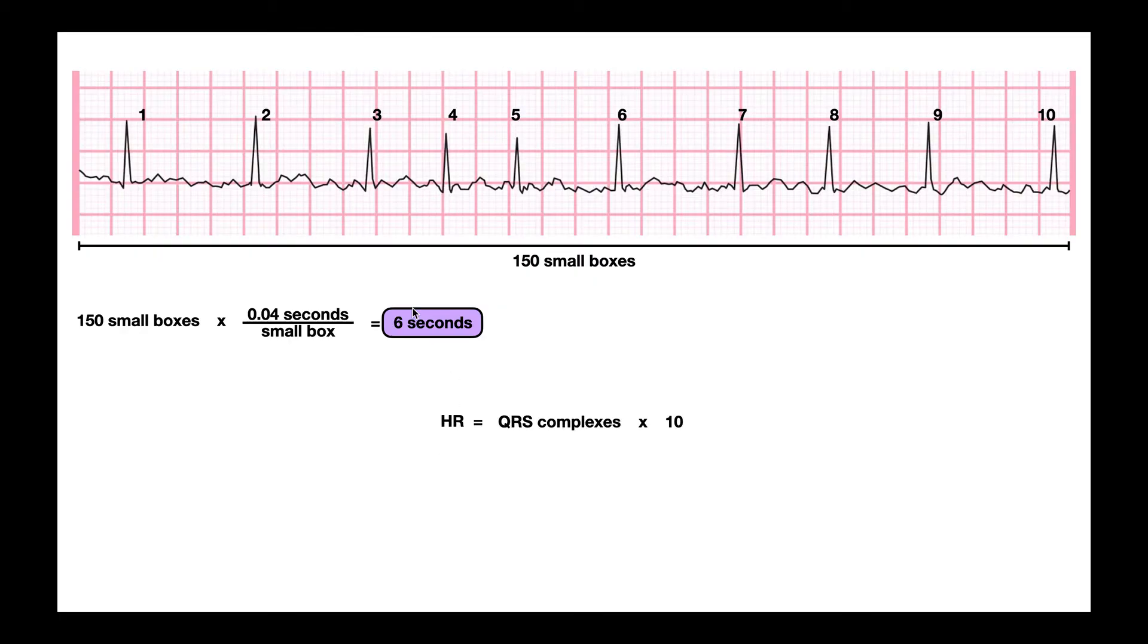The rule is my average heart rate over the course of this 6 seconds is given by the number of QRS complexes times 10, always times 10. So I have 10 QRS complexes, I multiply that by 10. So my average heart rate over this EKG strip is 100 beats per minute.